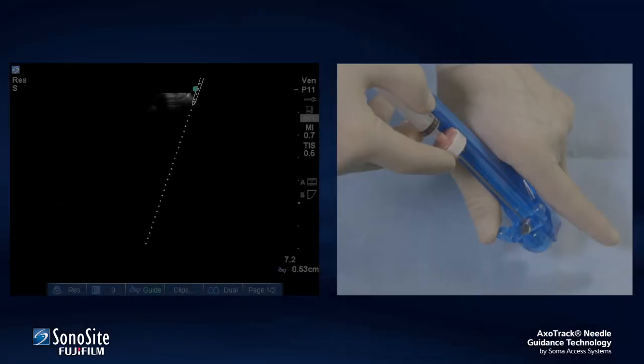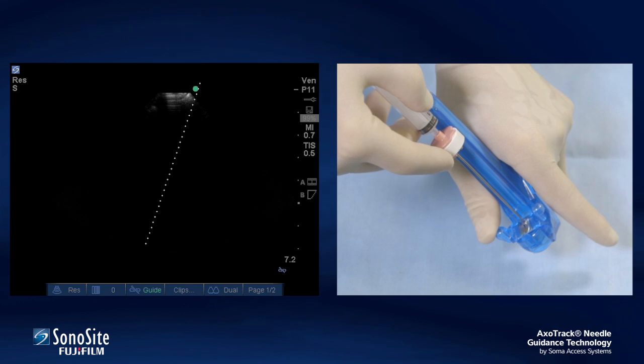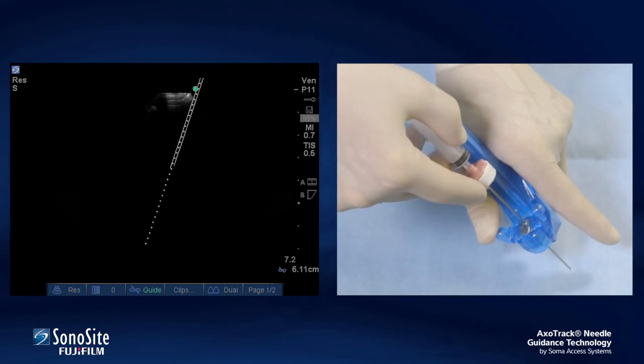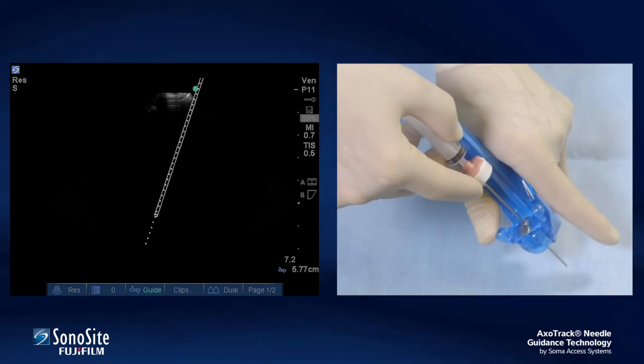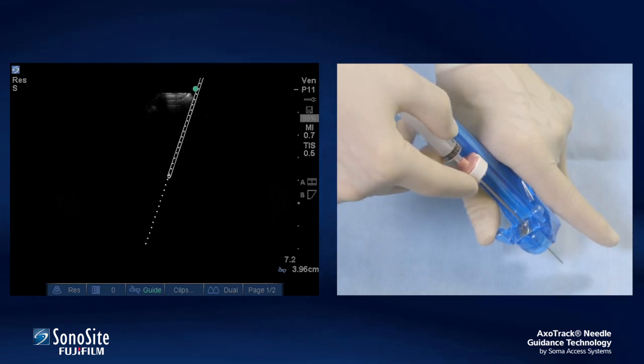Finally, the practitioner slides the needle slowly forward and backward through the needle guide and observes the virtual needle on the sonogram. The motion of the virtual needle should mirror the motion of the actual needle. The needle is then withdrawn after these tracking verifications and placed in the sterile field until utilized in the following procedure.